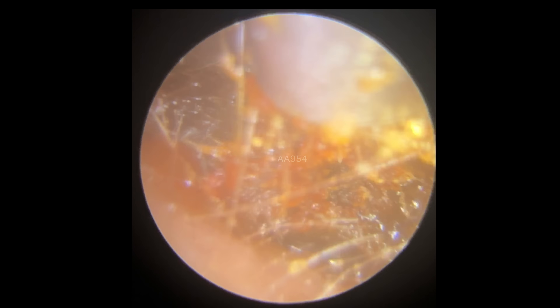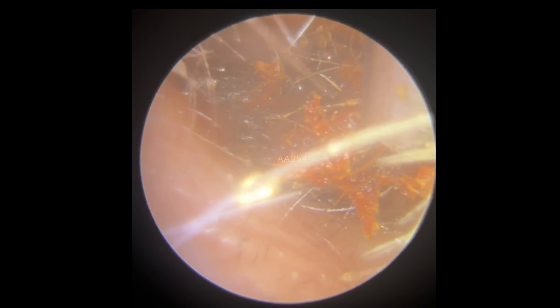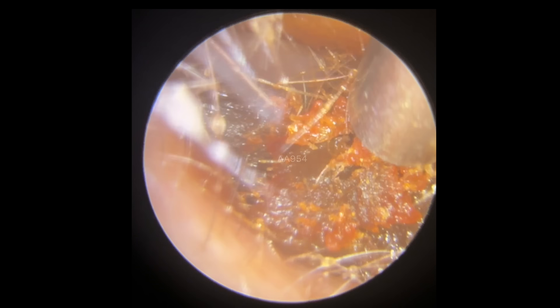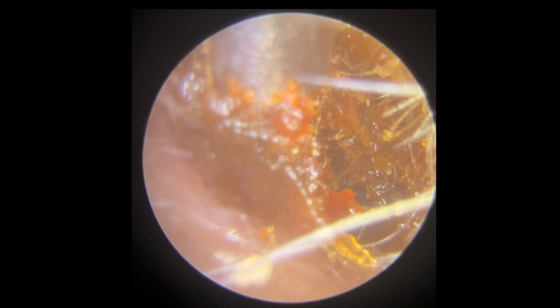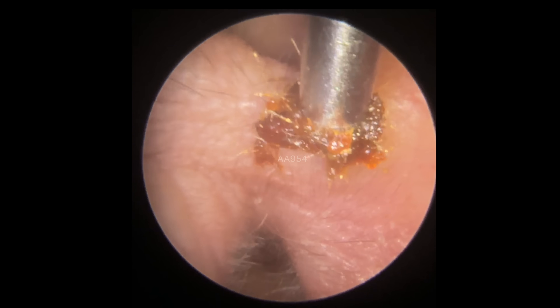You can see I'm almost rolling it, trying to turn this plug — but those hairs are binding it so well together. Let's give this a little more of a wiggle and that's going to detach the whole front section. There we go, that's come away. You tend to work on the bits that are jutting out the most first, just because it's a more uneven surface to try and get a suction grip on. If you can get a grip on those pieces and pull them out first, you leave yourself with a much flatter surface to work on.